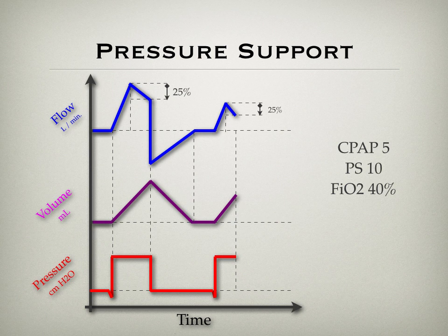So why patients like this so much is because now they have control over when to start breathing, when to finish breathing, how much effort they want. They can put as much effort as they want or as little effort as they want. And they are not forced to take any tidal volumes that they don't want. So breaths are unequal in many of those breaths.